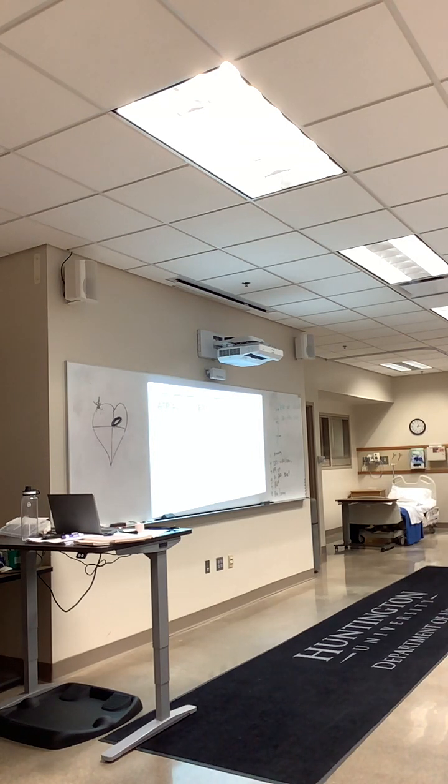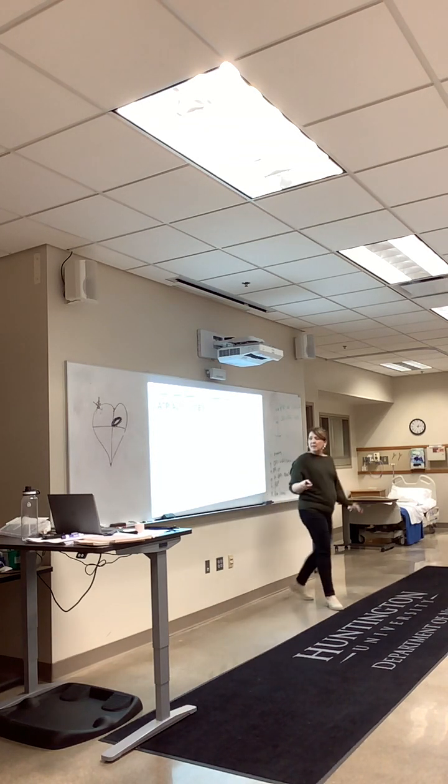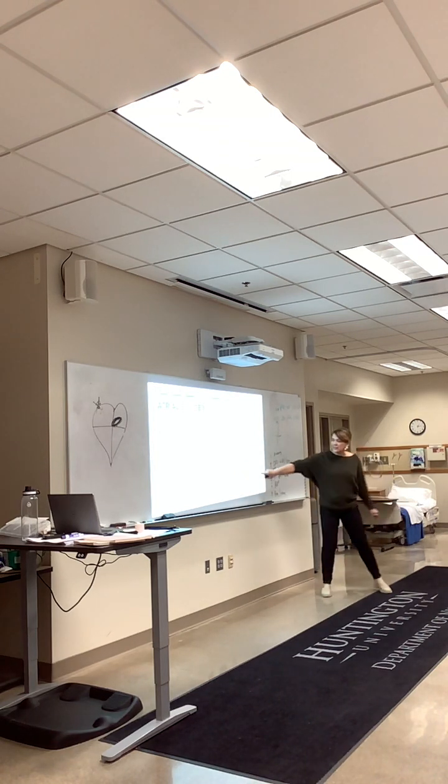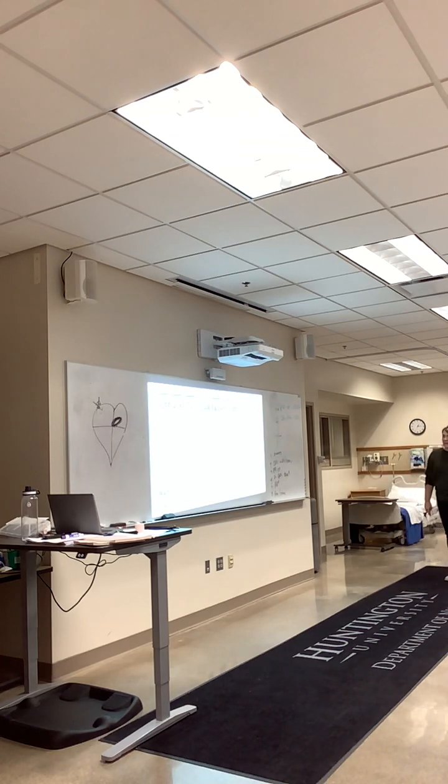The way you tell the difference is that most of the time with AFib, it's smaller and almost looks like there's nothing there. Whereas here it's a little more. Right, absolutely. Some people confuse it with normal sinus rhythm, because this one has only two waves in between. It's a faster rate. You're looking at the shape of it, see how it angles forward? This is another example of it. The more examples you look at, the better.